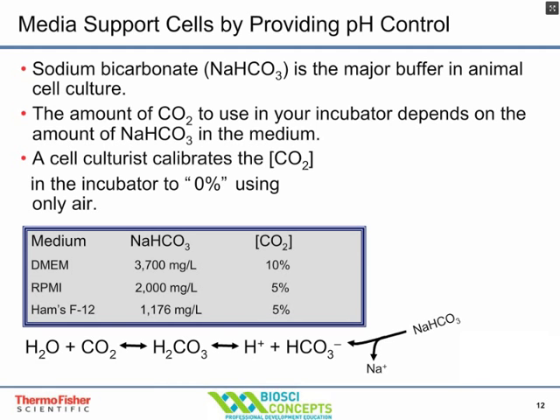If you're growing cells in a 10% CO2 incubator, the CO2 concentration is 10% higher than what's in the atmosphere. This means that if you remove your cells from the incubator, put them on the microscope or in the biological safety cabinet, the pH of that media will increase due to lower CO2. This is why if you leave your cell culture dish or flask out of the incubator for a period of time, if it has phenol red, it turns purple.